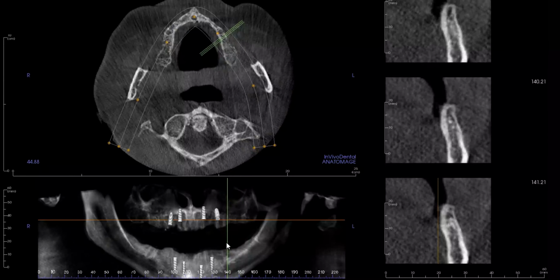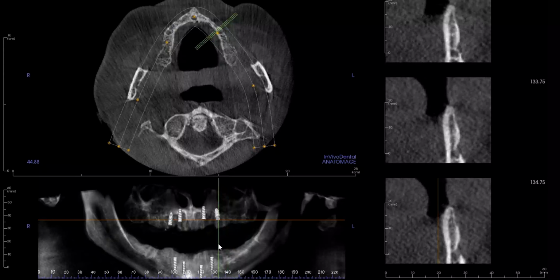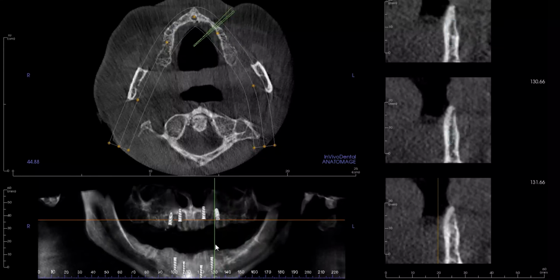Again, the goal of an all-on-4, as it was originally devised, was to place a tilted implant anterior to the mental foramen so that we don't have to graft posteriorly. But sometimes the patient has enough bone in the posterior, in which case, why would we tilt an implant if we don't have to? Yes, we can tilt implants if we splint them together. That is the beautiful thing that came out of the All-on-4 concept, but we don't need to do that.